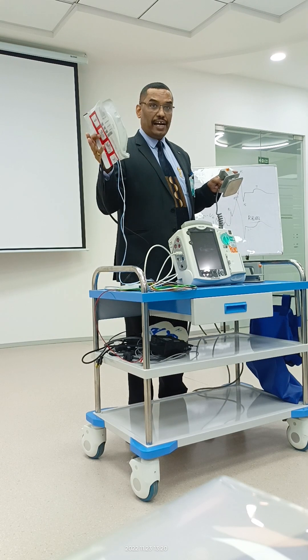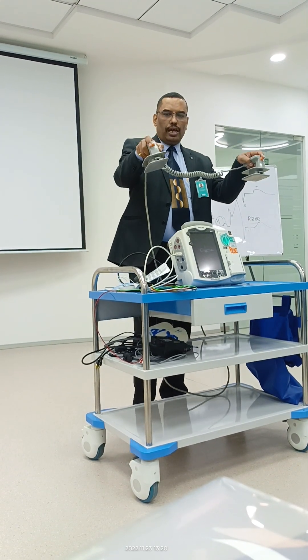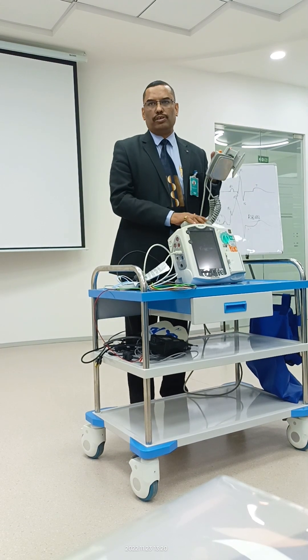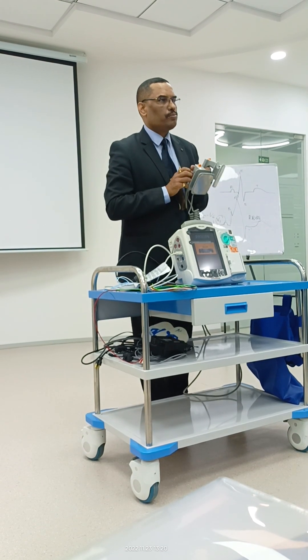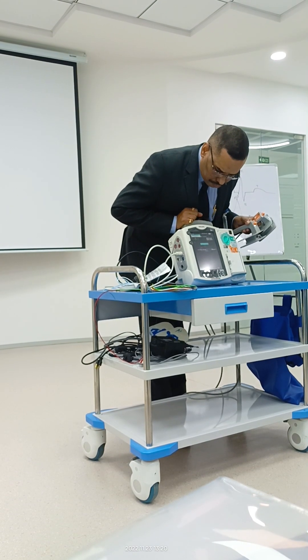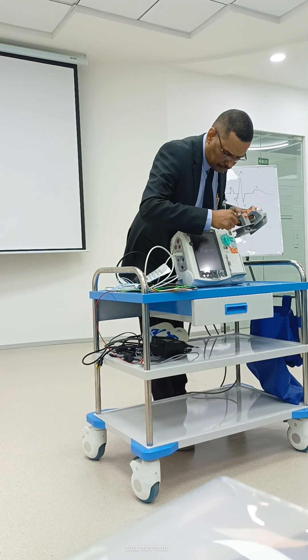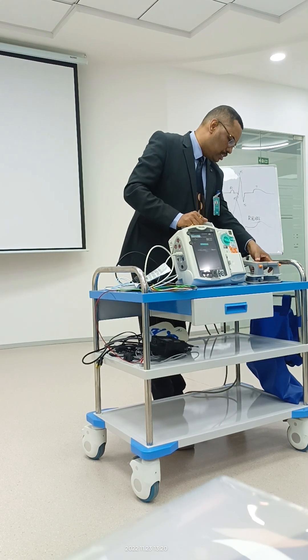These are called pads and these are paddles. Now how I am holding this — I can hold it like this, and here is the button for charging. I can also charge from the machine. If using paddles, never use any other button. Suppose the patient has a shockable rhythm — I have selected 200 joules.